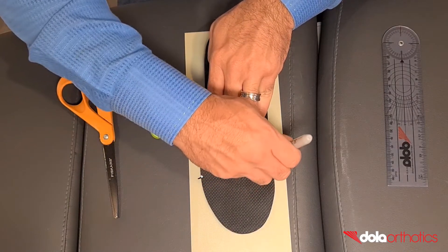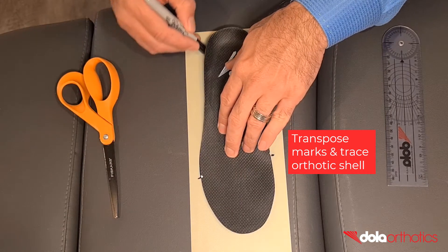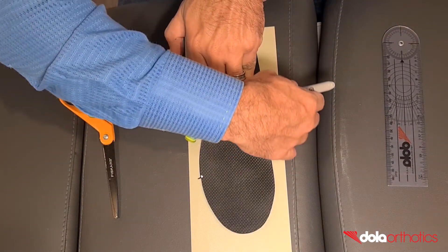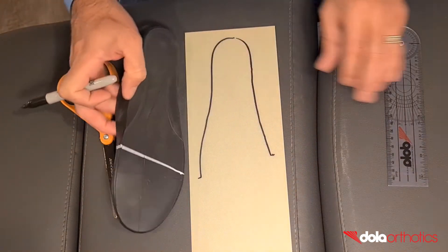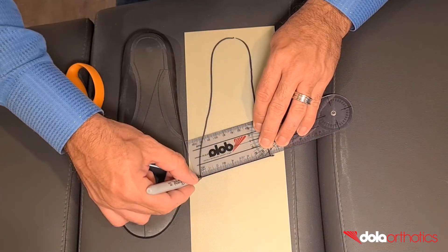Place the heel of the orthotic at one end of the Dollar Tech plate. Transpose the medial and lateral orthotic markings onto the Dollar Tech plate. Trace around the orthotic shell connecting the medial and lateral points.